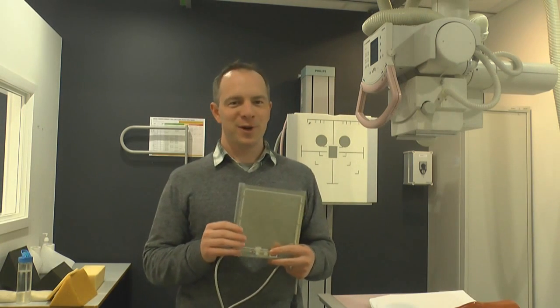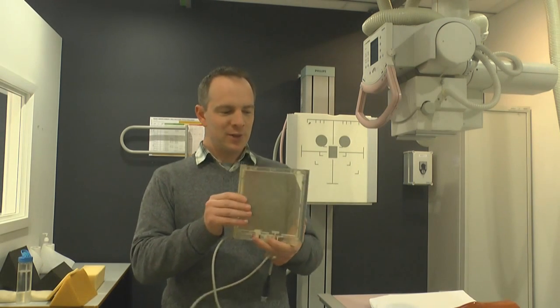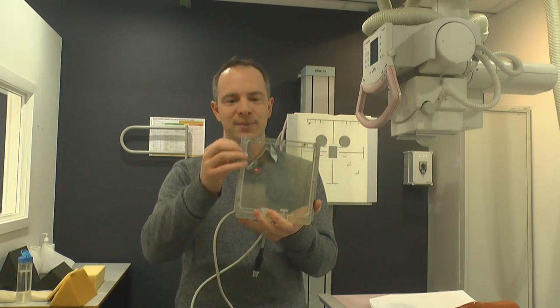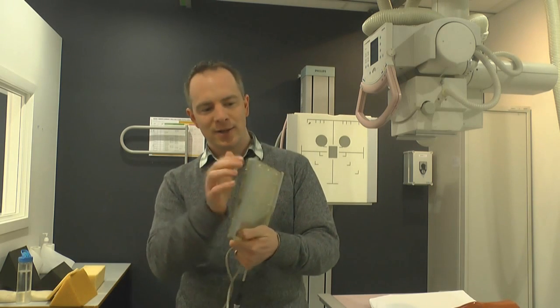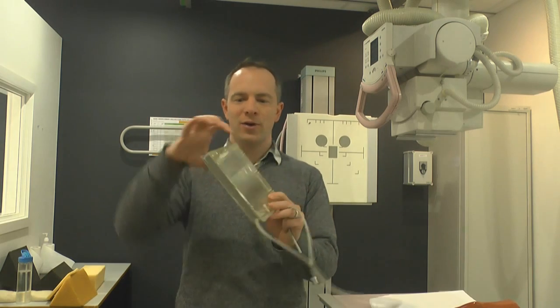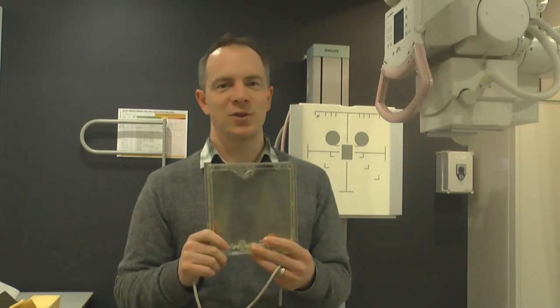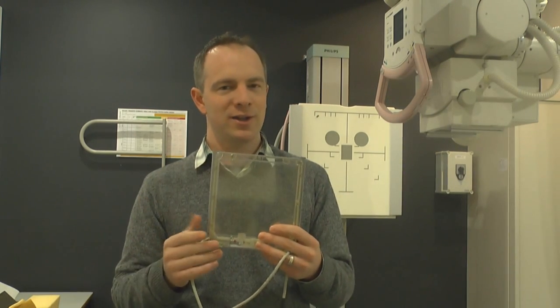So how does a DAP meter work? Now, I'm sure you remember from previous lectures about how an ion chamber works, and this is essentially an ion chamber. It's a gas-filled chamber. So what we see in the device is some metal strips around the outside. Hopefully you can see those here. And it's basically plastic covering on two sides, and inside it is just air. That air is going to become ionized in response to X-rays, which are of course ionizing radiation.